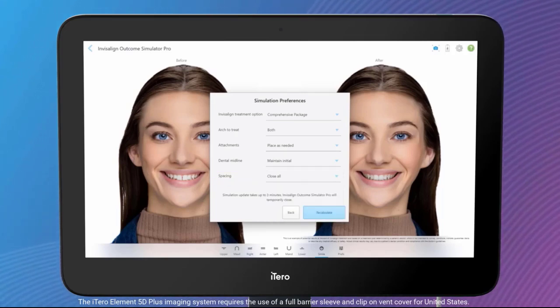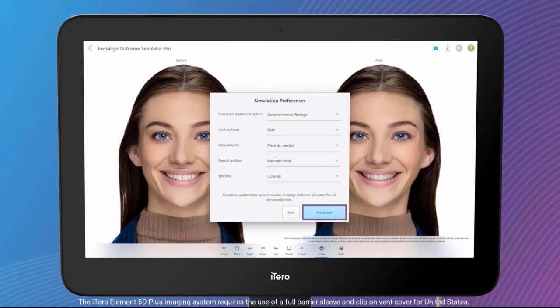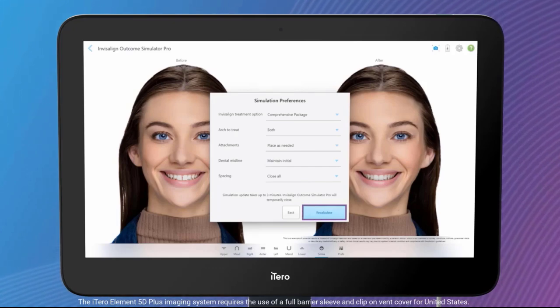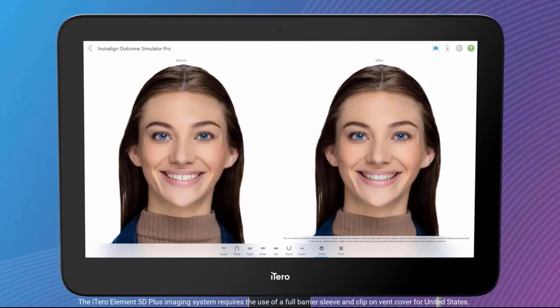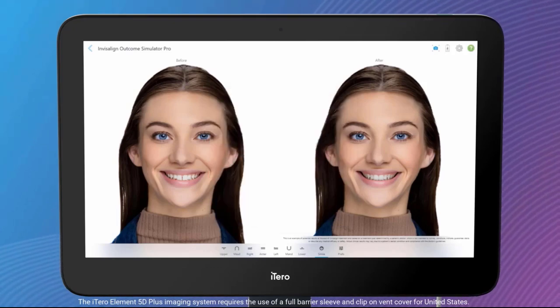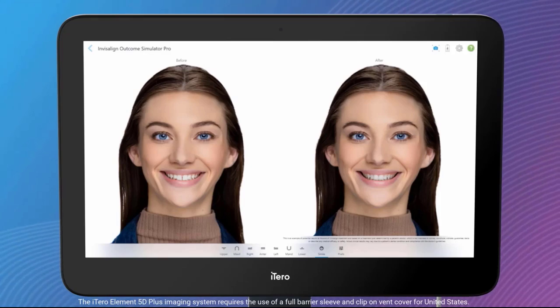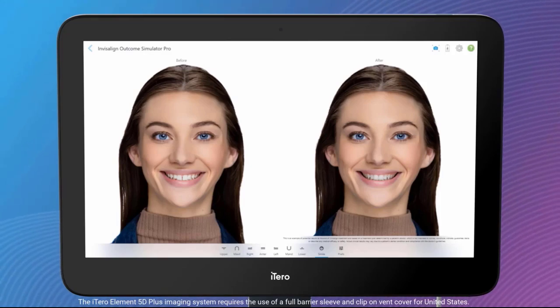Once you have selected simulation preferences, tap the Recalculate button. After your preferences have been selected, the simulation will close and will be updated according to your preferences. This may take up to 3 minutes.